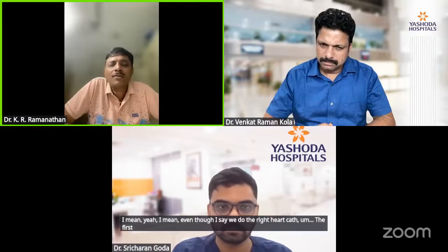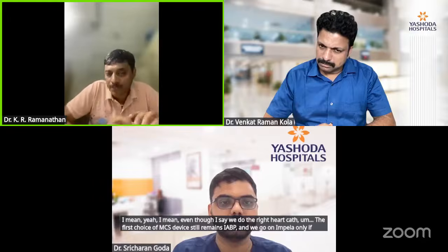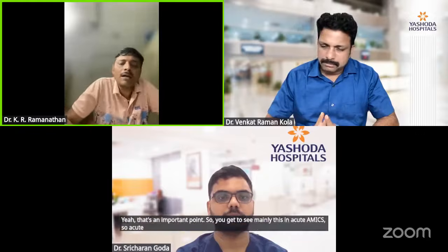Isolated LV dysfunction, the first choice? Impella. Yeah, even though I say we do the right heart cath, the first choice of MCS device still remains IABP, and we go to Impella only if IABP is not working. So we do wait or give the patient a chance on IABP before we insert Impella. And this is about myocardial infarction cases across the spectrum with only left ventricular failure. Yeah, that's an important point.